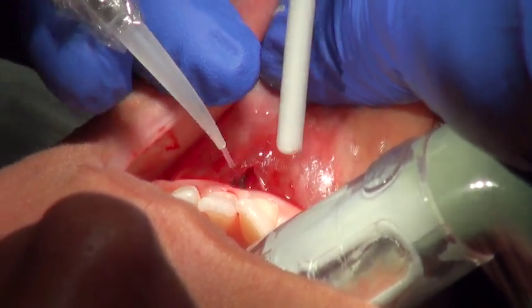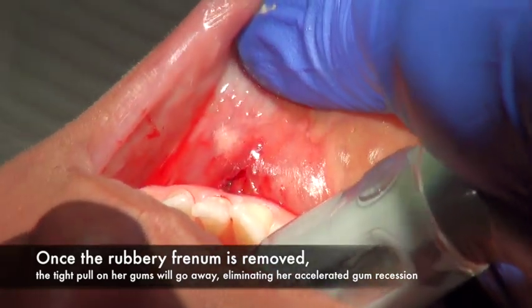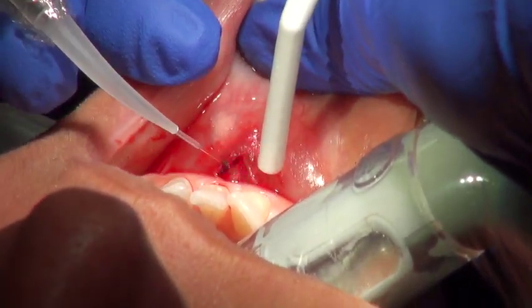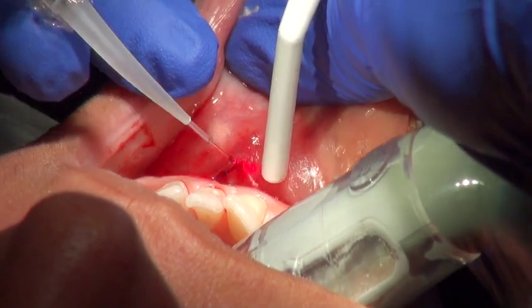So, do you take it down to where the periosteum is visible? Nah. I'm just looking for a diamond shape that will be released. Actually, I'm deep enough. I just have to go laterally a little bit. Can this roll back together? It could, but it probably won't. That's why I'm trying to be careful that I don't have to do it again.